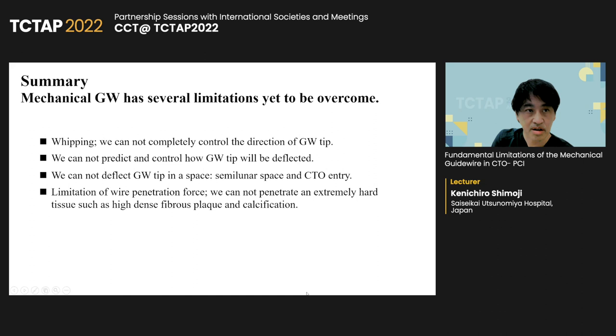So in summary, mechanical guide wires have several limitations yet to be overcome. Thank you for your attention.